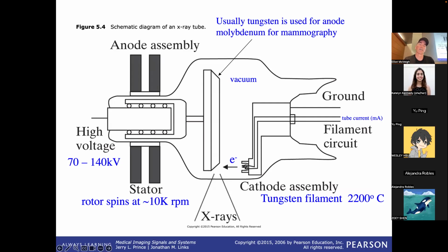The electrons fire across because of these voltages, and that's why the energy of the X-ray is in electron volts. It comes directly from this. Let's say we set the voltage to 140 kilovolts. If all of the energy of the 140 kilovolt acceleration of the electron goes in, you get a 140 keV photon, kilo electron volts, coming out.